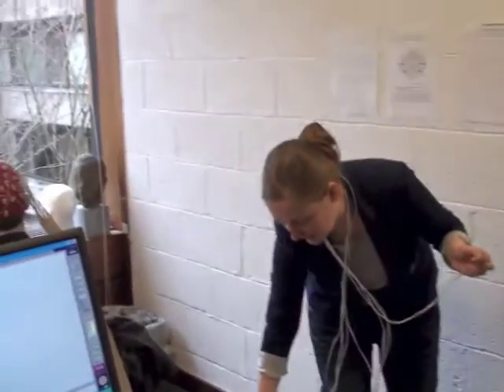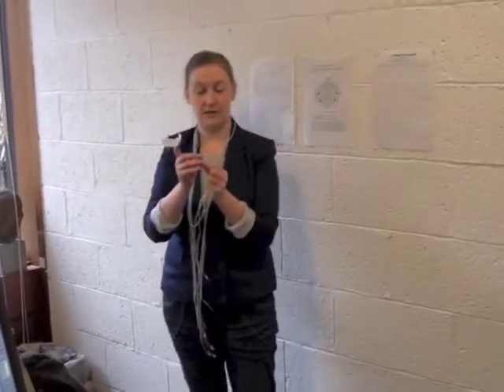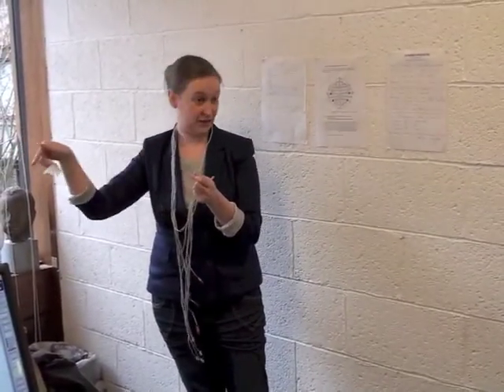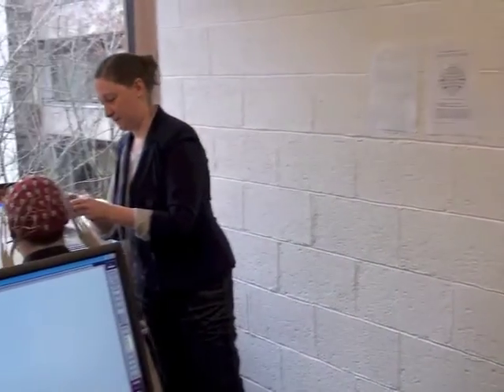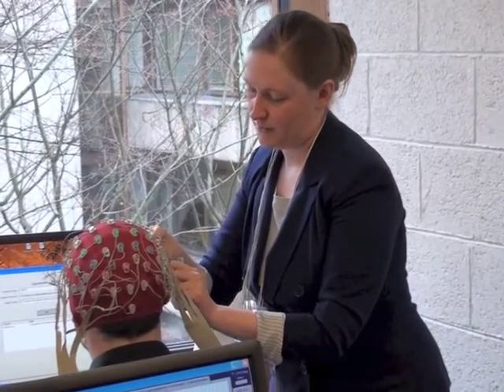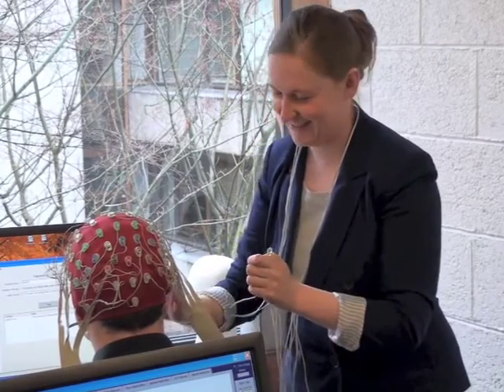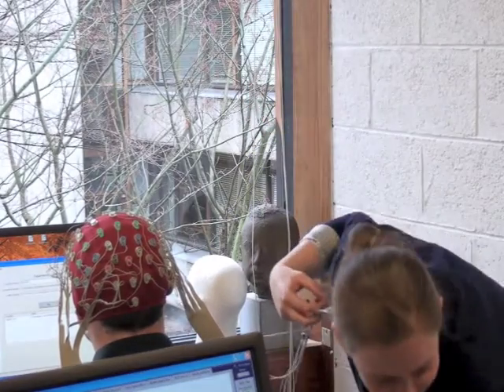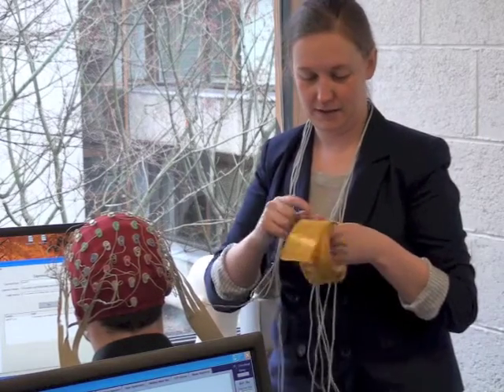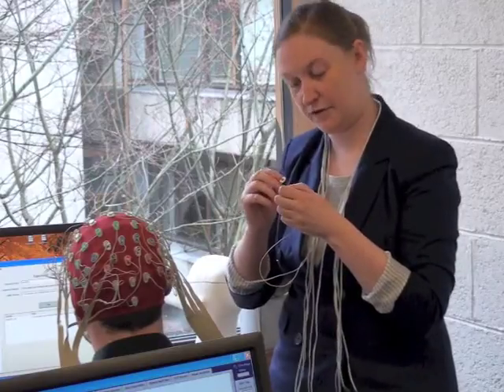Okay, then when you stick each of these on, this is another thing you prepare before the participant gets here. When you stick each of these on, you just put a piece of surgical tape over it, hold it in place. Because with these, they're not stuck into the cap, so they would just fall off, even though there is double-sided sticky tape. So EX1 goes on the left temple. Put it there. And you hold it there. EX2 then has to mirror that, because all the numbers in order mirror each other left and right.